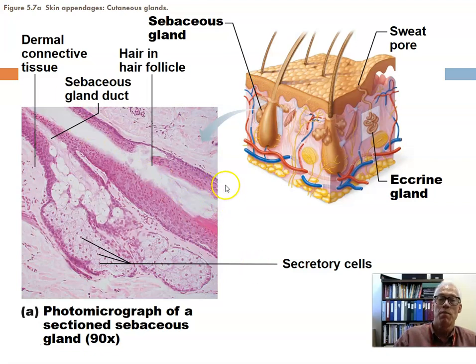If I showed you a picture, I'd probably make sure you could see the hair bulb, or the follicle bulb, I mean, which would be this rounded part. And possibly even let you see a pigmented part of the hair shaft itself inside the follicle, so you'd really know what you're looking at. But associated with the hair follicle is a gland called the sebaceous gland, and here you see it depicted in cartoon form. Here you see it in histological section.